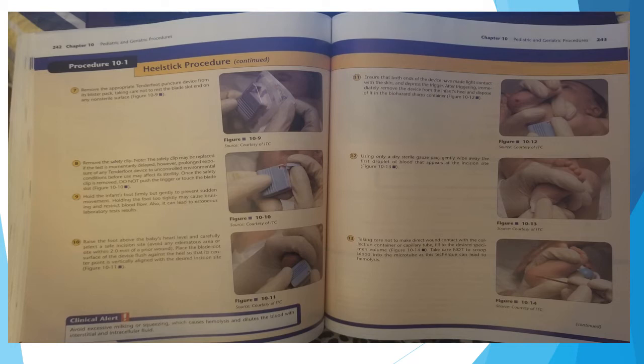Place the blade slot surface of the device flush against the heel so that its center point is vertically aligned with the desired incision site. Clinical alert. Avoid excess milking or squeezing, which causes hemolysis and dilutes the blood with interstitial and intracellular fluid. Ensure that both ends of the device have made light contact with the skin. Depress the trigger. After triggering, immediately remove the device from the infant's heel and dispose of it in a biohazard sharps container.